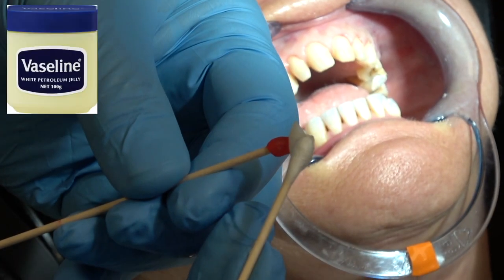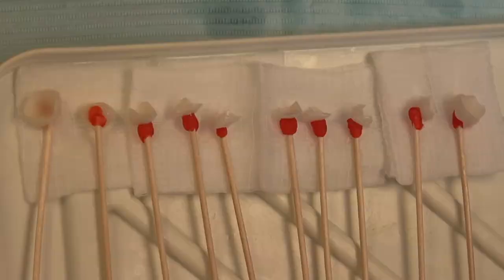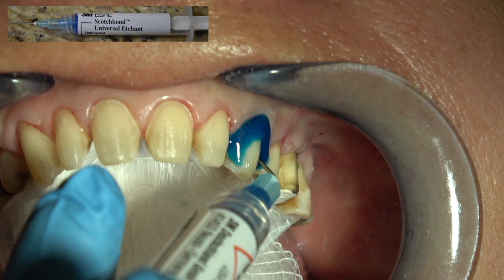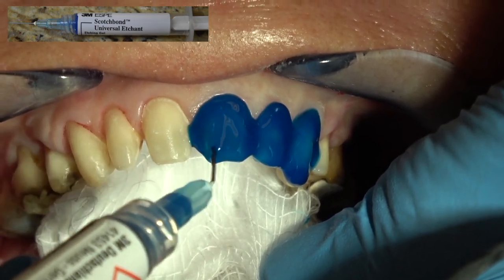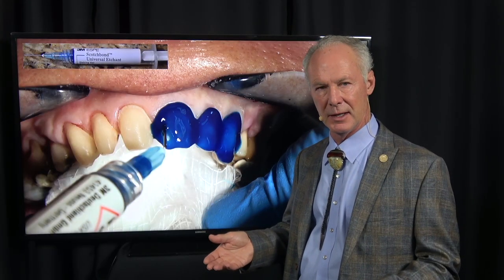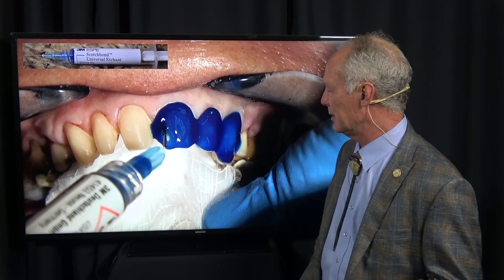Place Vaseline on the interproximal contacts of both the crowns and the veneers. These Emax veneers have been treated and now wiped with isopropyl alcohol. Dry that off with your air syringe and then place Vaseline on the interproximal contacts. Then I'm going to use this carrier on the veneers and crowns because it makes it much easier to carry them to the mouth. Here they're all ready to go. Then I'm going to etch the teeth to be veneered with 38% phosphoric acid.